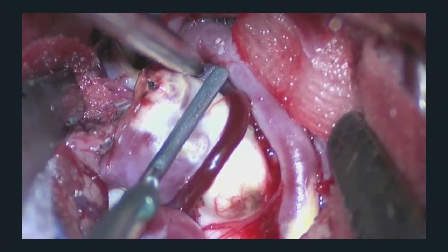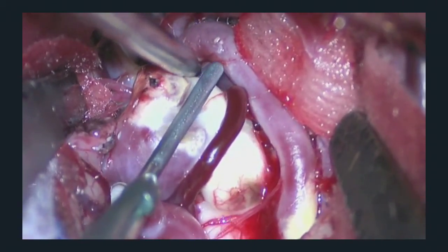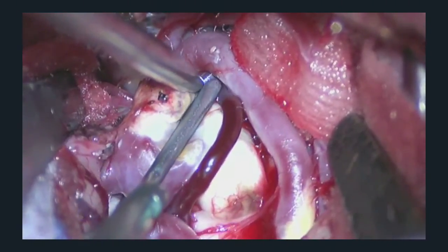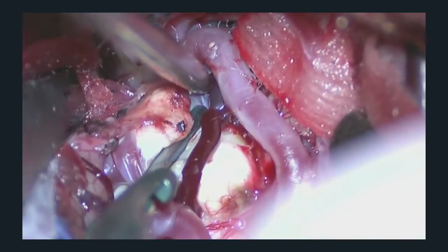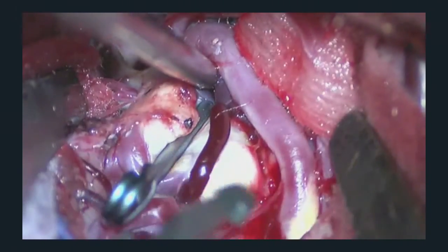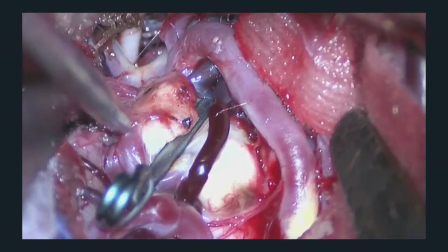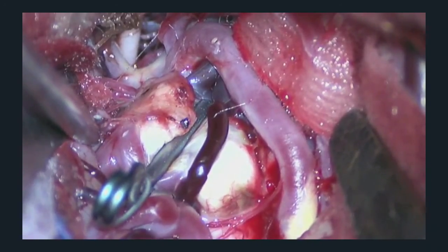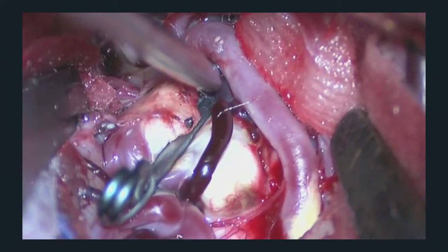You can see that this blood vessel actually has a white color to its wall, and that's because of calcium. And this is actually a patient who developed a stroke from this calcium going into the head, and that's how we found out that she had an aneurysm. So in this instance, trying to pack a bunch of platinum into the inside of this aneurysm, which already was showering debris into her brain, didn't make any sense, right? That's not a good option for her. What we need to do is directly clip and eliminate the aneurysm here.